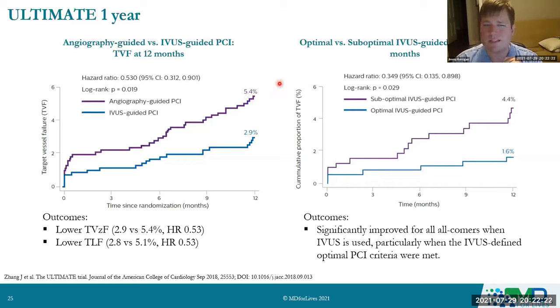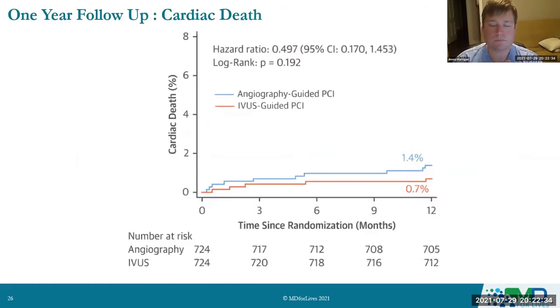So really, and this hasn't been done to my knowledge, please correct me if I'm wrong, I would imagine there's probably not much in the way of statistical significance if we can't meet those criteria. And the biggest reason we don't meet those criteria is because of the lack of vessel preparation potentially.